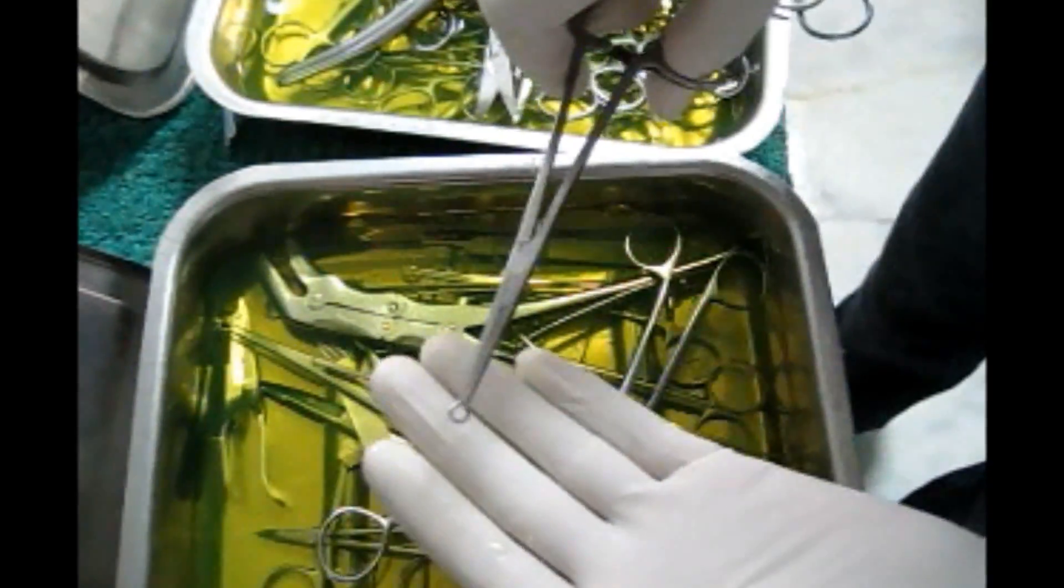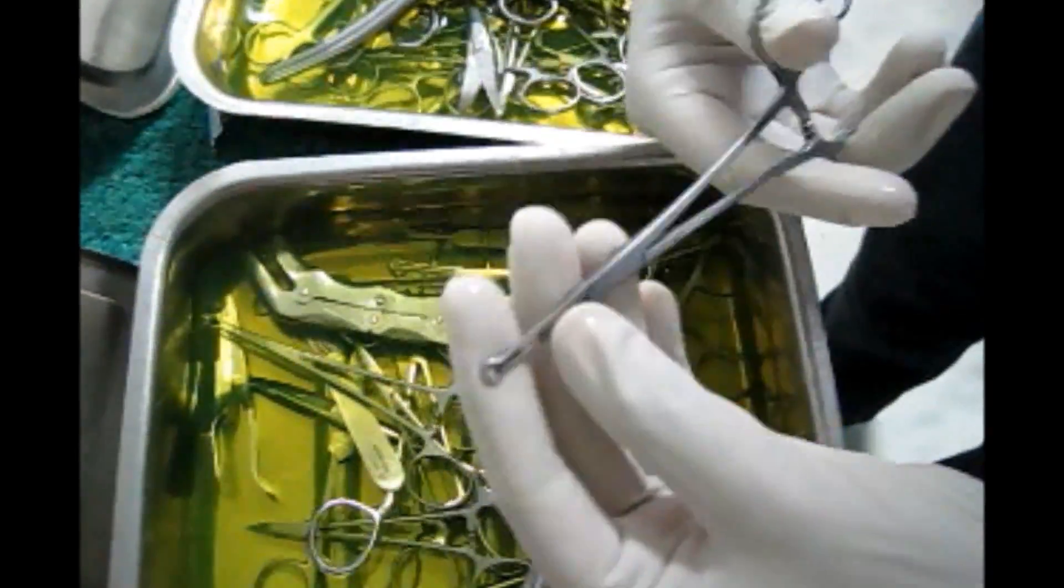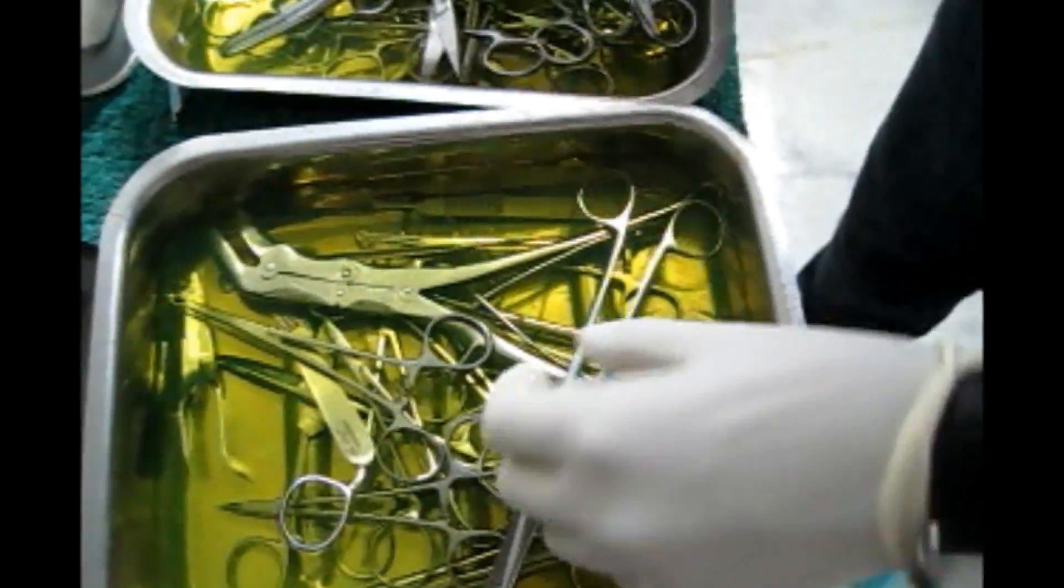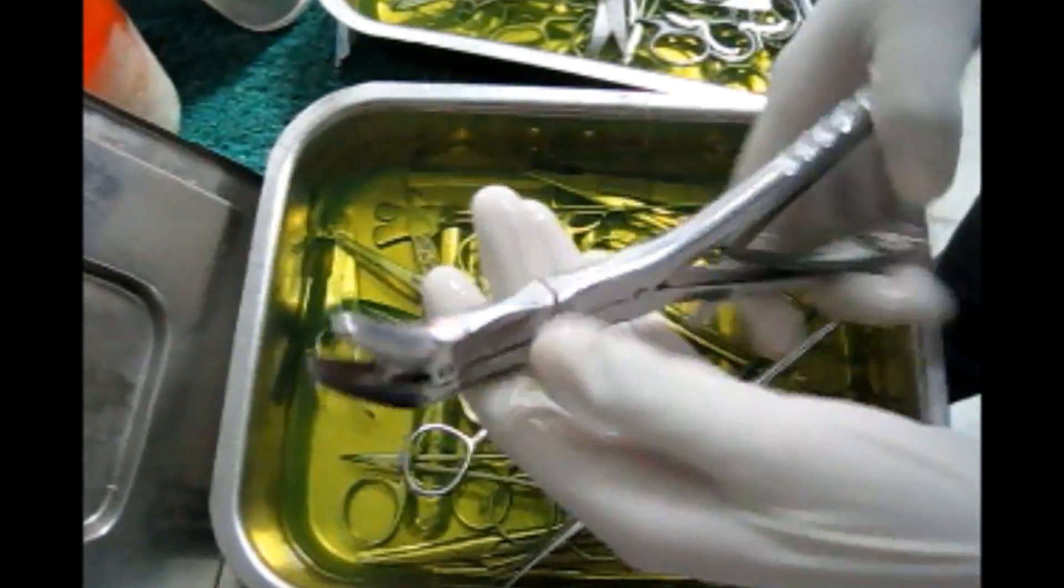Now, this is the ring forcep which is used to hold the vas deferens in the vasectomy. You can watch our vasectomy procedure.